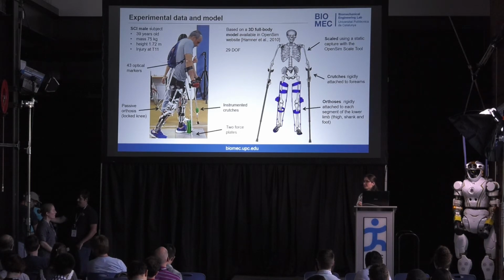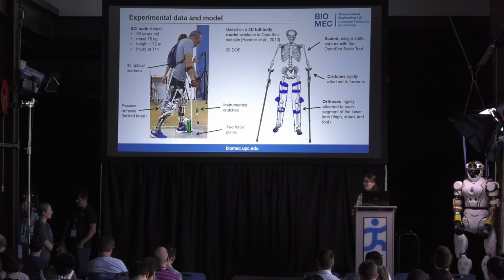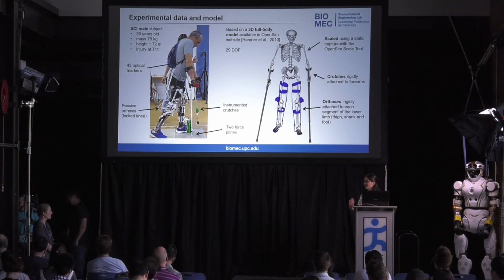And also when you find a combination that seems to work correctly, you don't know if it's because you are tired of trying or it's the optimal for that patient. We don't know if it is difficult to do this also using optimization or prediction, but we want to try that because we think that maybe it will be easier and quicker to implement, and for the patient also it will be better.